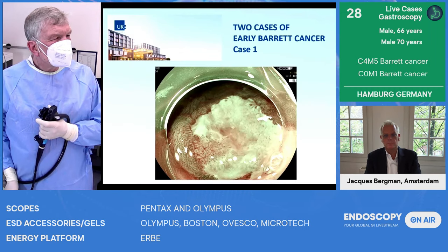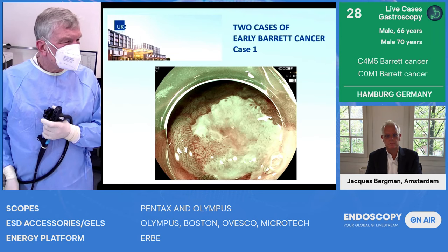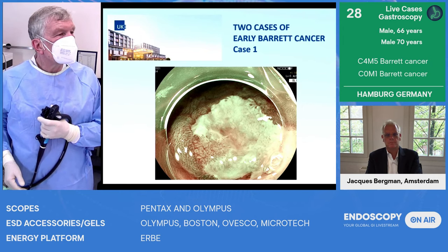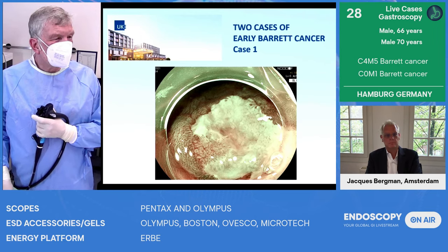And only if you know, actually, you see that on the left side, there's inhomogeneous tissue and astructural tissue. The rest of the Barrett looks completely normal. And if we compare it with the previous pictures, this must be the place.